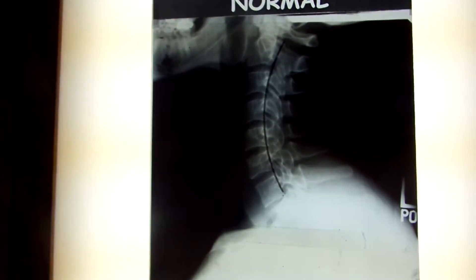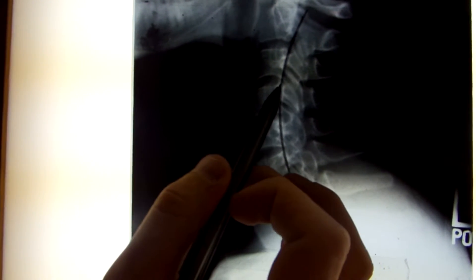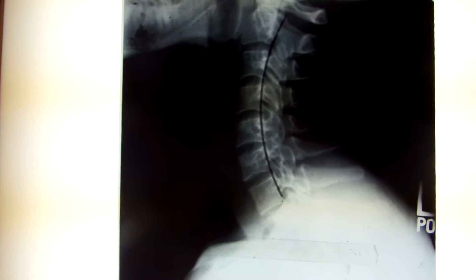So first in a normal x-ray, in a normal spine, what we want here is this square here is the vertebra, and in between here this dark space is the disc. So we've got vertebra, disc, vertebra, disc, vertebra, disc — alternating segments all the way down through the spine.